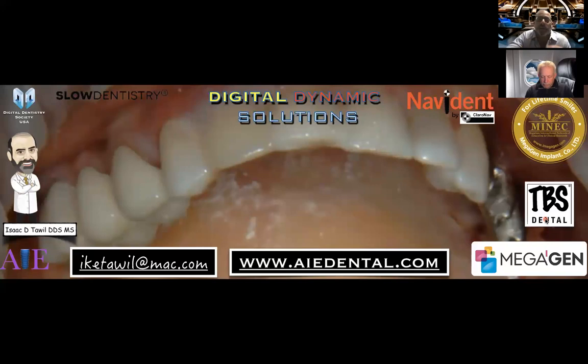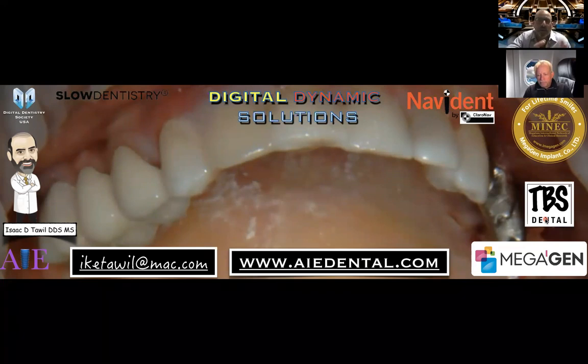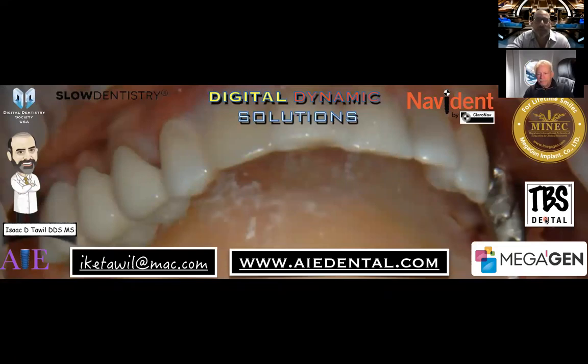Because as we know, xenograft doesn't turn over. It's just scaffolding and holding bone, and then bone forms in between. So with the osteodensification, we may have squeezed all that natural bone and blood vessels that were supplying and housing that, forming lacuna around those xenograft particles, and we eliminate that, and then inside can end up looking like Chernobyl. It can all turn to mush, and it won't develop properly, and we may have a massive failure, which we found early on. We learned early on with osteodensification not to graft sites, not to use xenograft as a graft material and then come back and graft it.